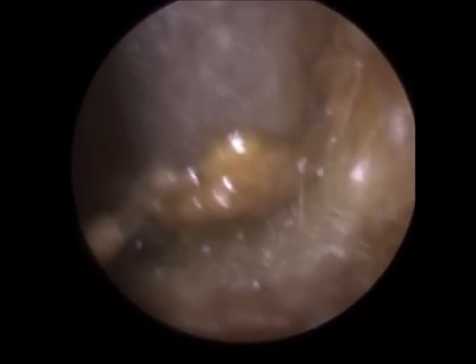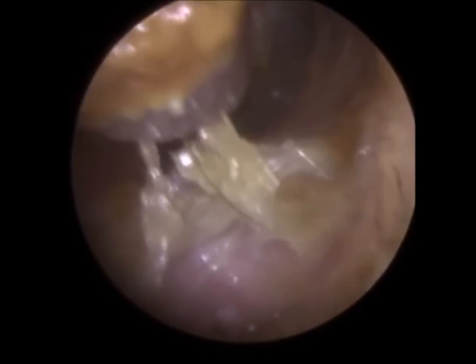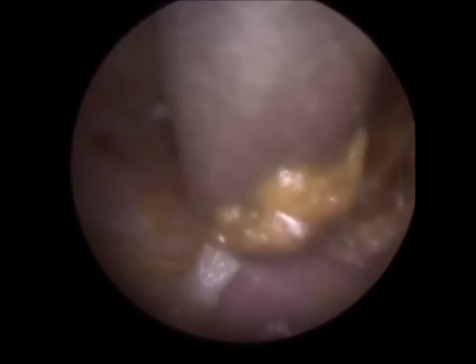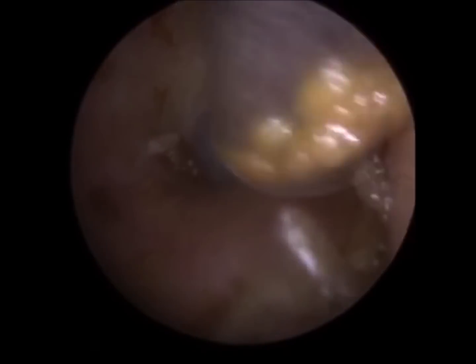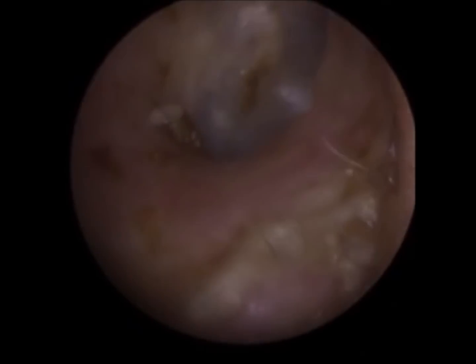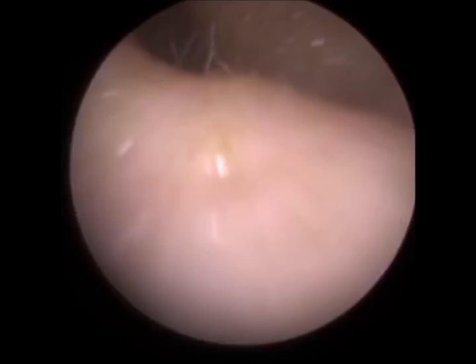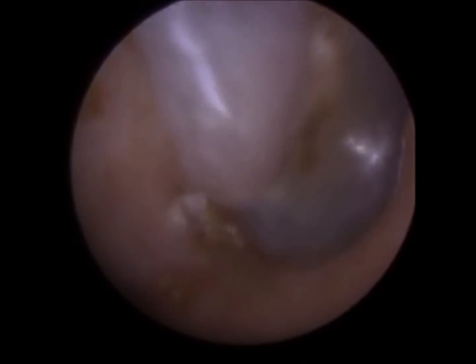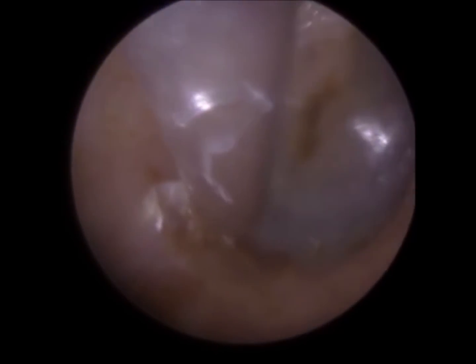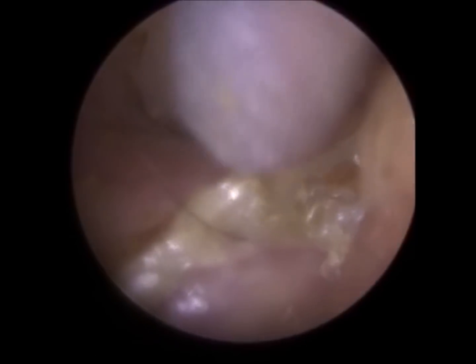So when we're in the cartilage portion, we sometimes can peel the skin off, but the skin was quite thick and it just wasn't ready to be removed. There's no clinical need for me to remove that. But sometimes, however, when you do get a suction grip of skin, it just peels away quite nicely. And sometimes inadvertently, when you're removing wax, the skin does peel, and you feel that you should remove it because it can flap around in the ear sometimes, and that can cause a bit of irritation. But there was no clinical need, just a bit there, adjacent to the eardrum.